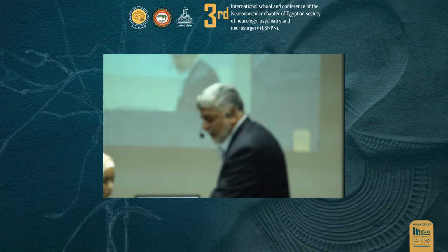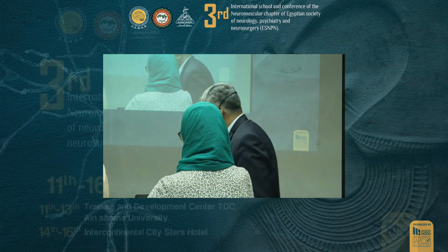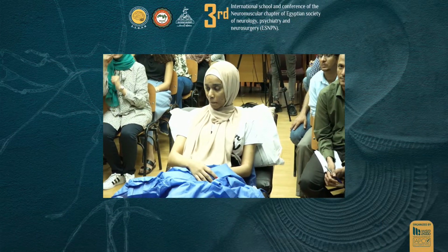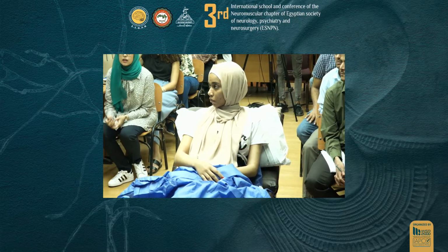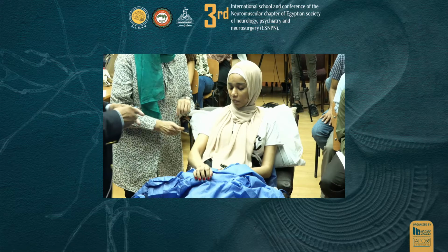I'll start from the normal side. If she can lie down, that would be great. Okay. So there are different kinds of needle electrodes. The one we use is called the concentric needle electrode. Needle, please, and a ground, please. So remember that just like nerve conduction studies, you got a recording, the 35, this one blue, 37, sorry. Yeah. So for the middle side needle, has she ever done this before? Has she had this before? So I'll use a small needle here and here. Okay?